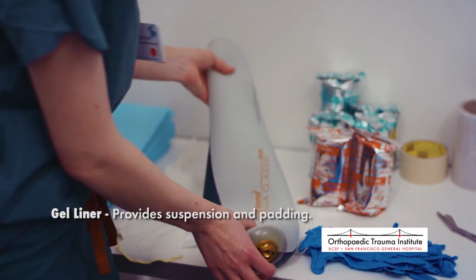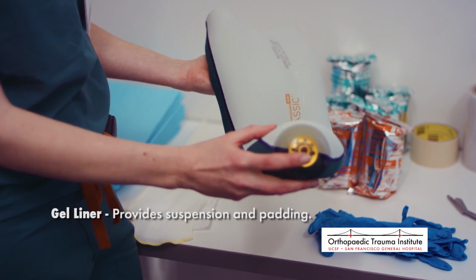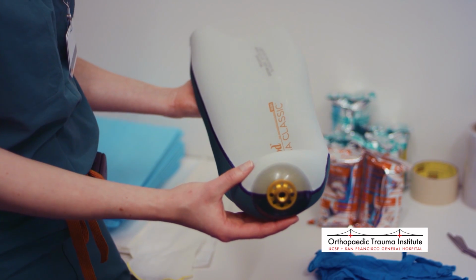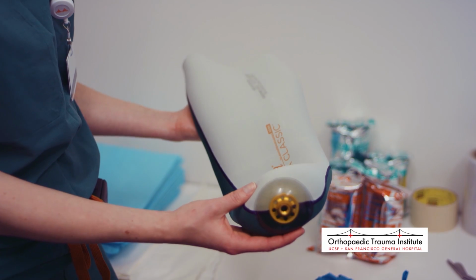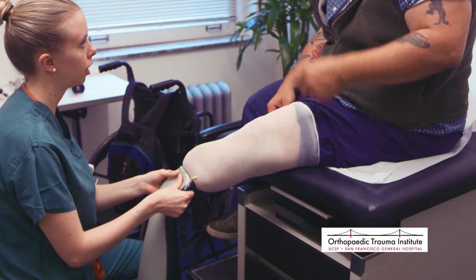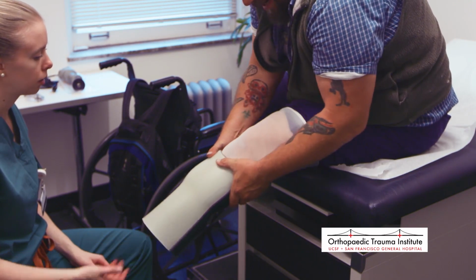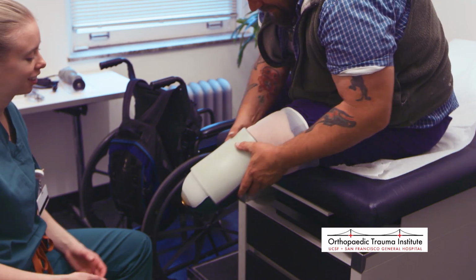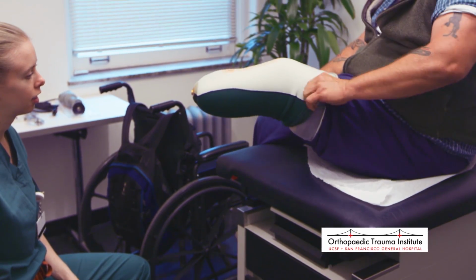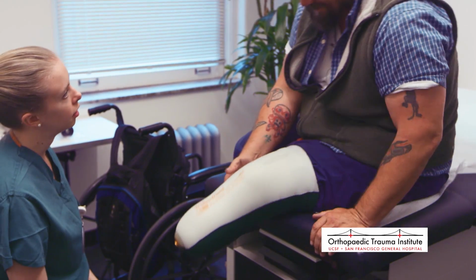Next, we have our gel liner, which is, in this case, locking to be used with a locking suspension later. We don't use this style for everybody, but this is one of our more common liners. This is what will roll straight onto the skin. We'll turn it inside out. It's cushioned on the inside to provide relief for bony prominences, but the gel gets rolled onto the leg and is sticky, so it provides suspension and padding.